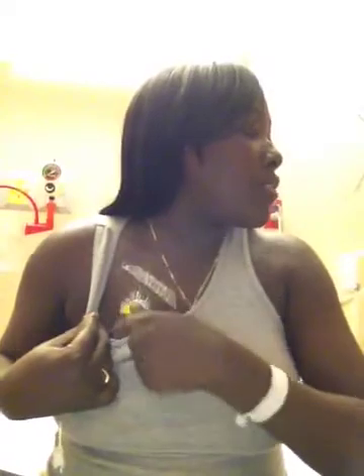Every time a nurse or anyone accesses your port, your face should be turned away from your port, this way. Your face will be this way. The nurse will be on this side. They're going to clean it real good. They're going to have on a mask. If he or she does not have on a mask, request them to put on a mask. They can't tell you no. You don't want this to get infected, and it can easily get infected. I know a girl who's had about 3 or 4 in the last 2 years. That's a lot of ports.